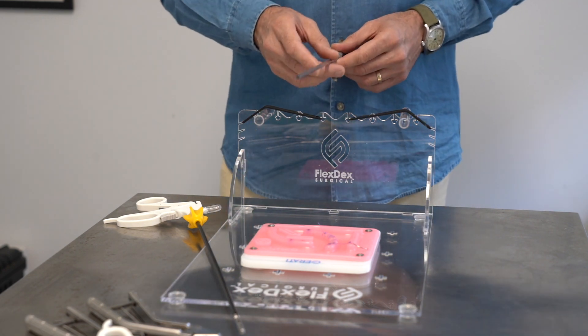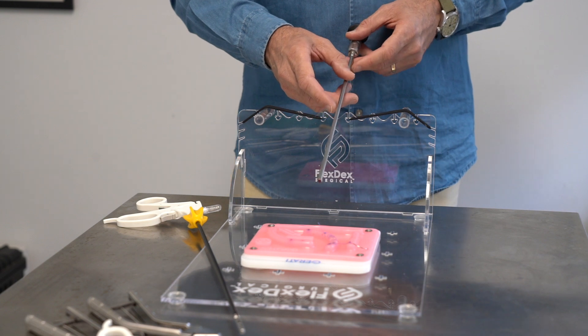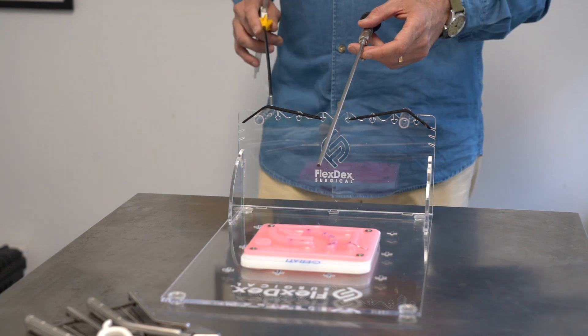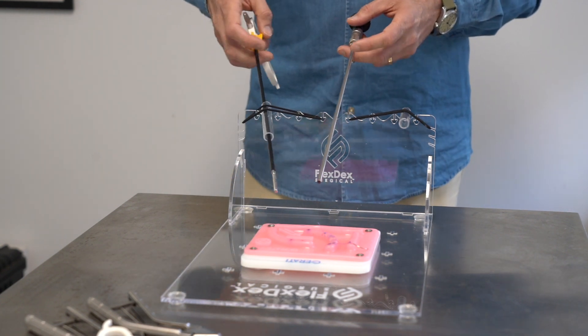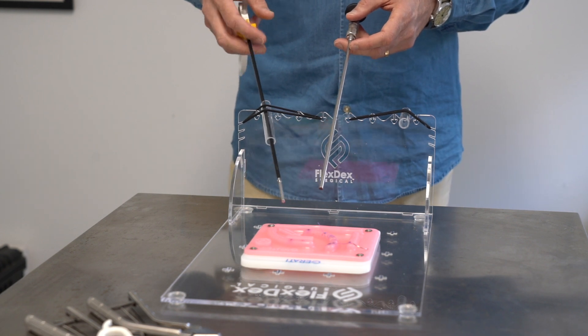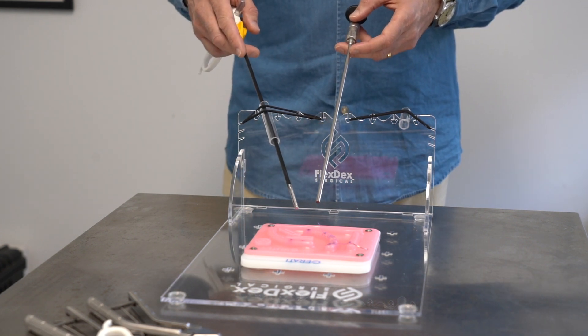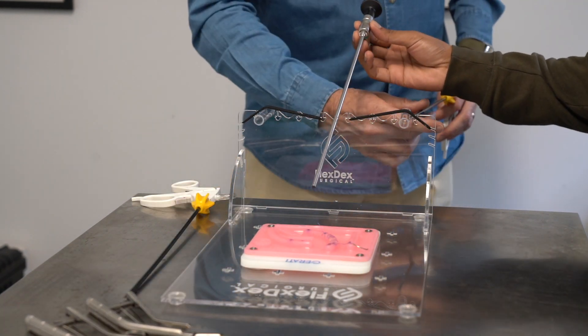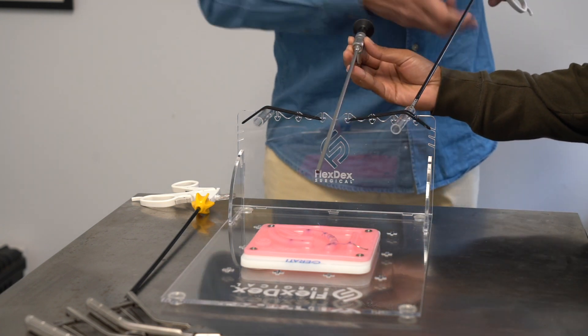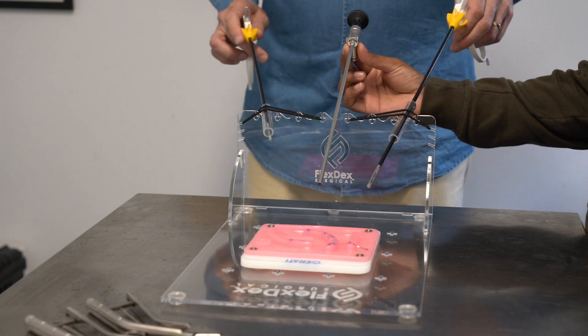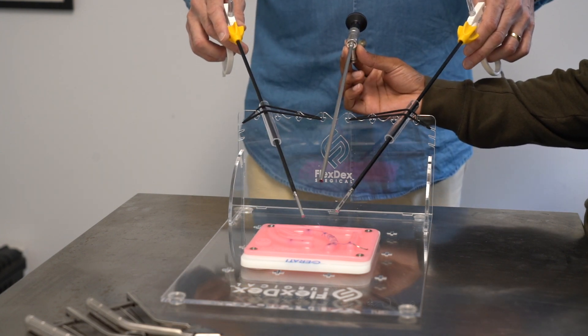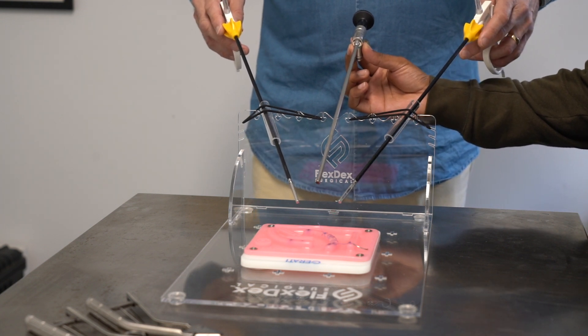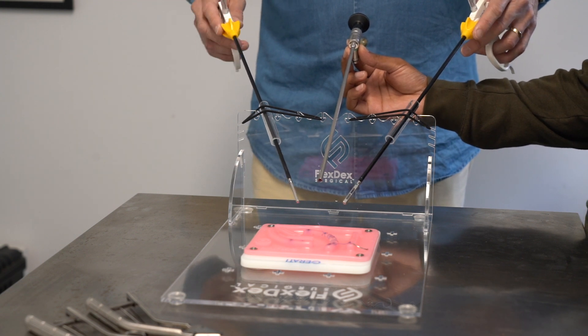Triangulation is a really important concept with laparoscopic surgery. The idea with triangulation is that you have the telescope or camera in the middle and then your instruments on either side, equidistant from the telescope, so that your movements and the target are always in the center of your laparoscopic field. When the scope is pointing at the target and the instruments are on either side, it gives you the correct orientation so that your movements are intuitive.